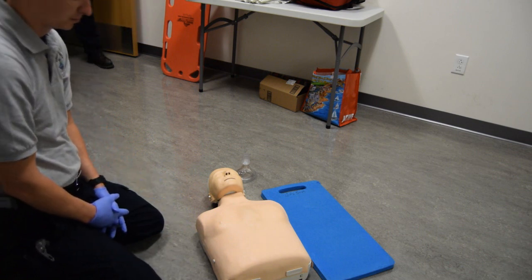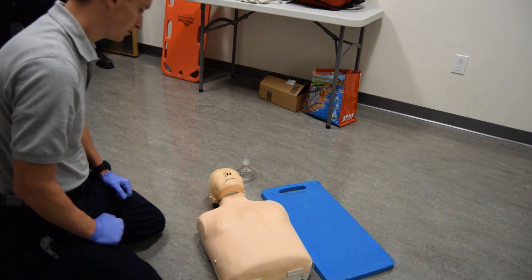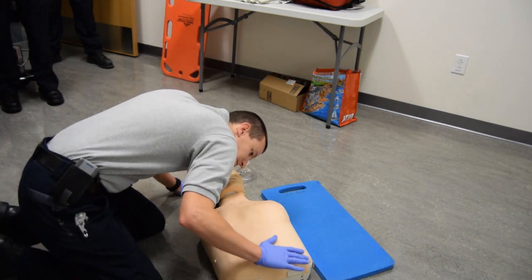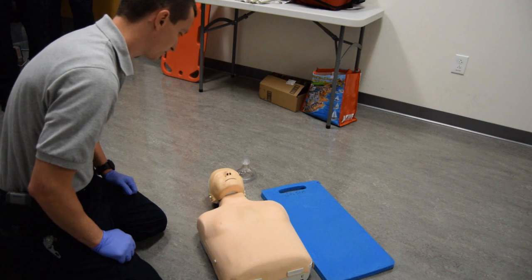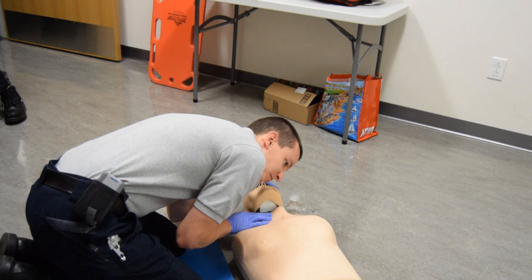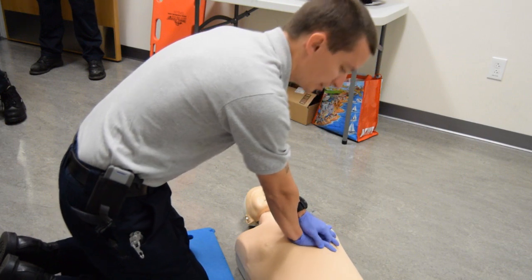The candidate checks patient responsiveness. Hey, you okay? The examiner informs the candidate the patient is unresponsive. The candidate assesses the patient for signs of breathing. The examiner informs the candidate the patient is apneic. The candidate checks the carotid pulse, then immediately begins chest compressions and requests additional EMS response. Can someone call 911 and give me an AED?